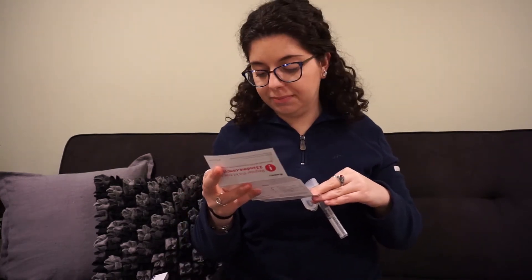It also says that most people take two to five minutes to spit. Interesting — I wonder where they got their data from.